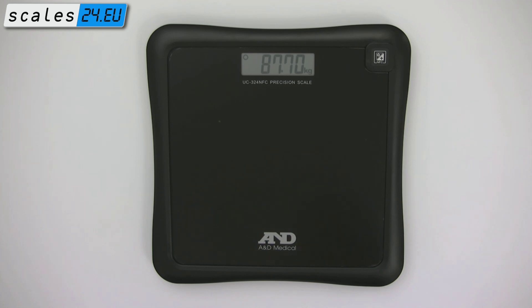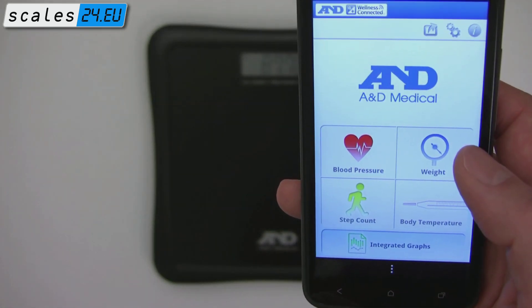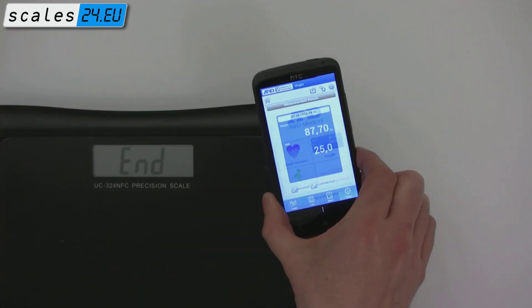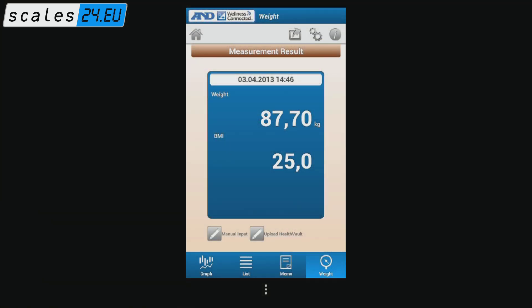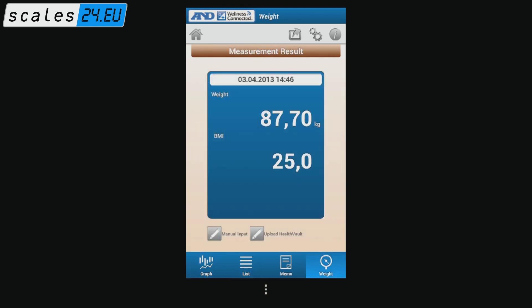To transfer it to your smartphone, start A&D's Wellness Connected app and hold the phone close to the communication area on the scale. You can use the app to view your measurements as a list or in graphical form, or upload them to Microsoft Health Vault.